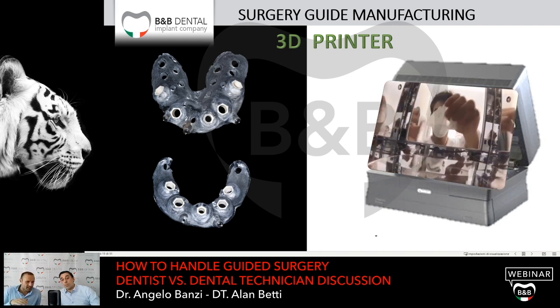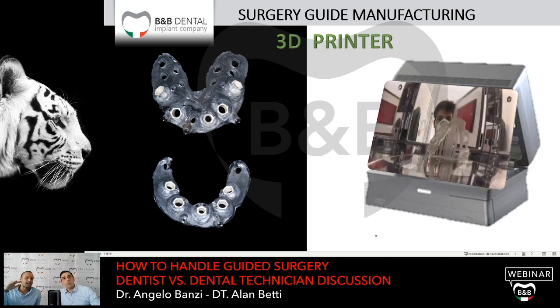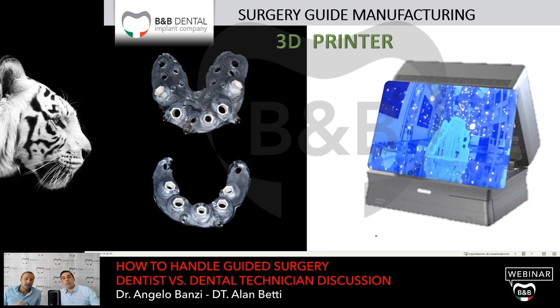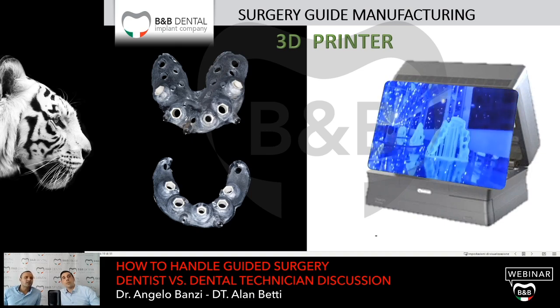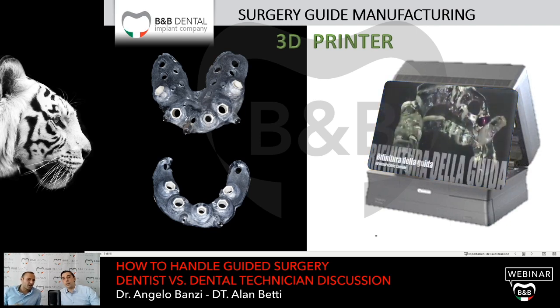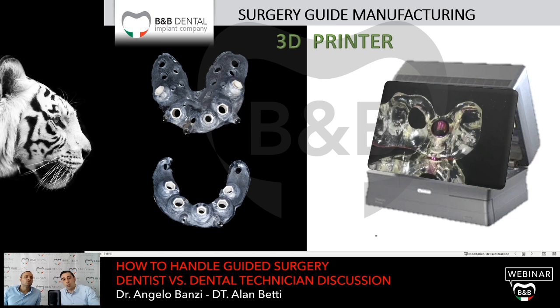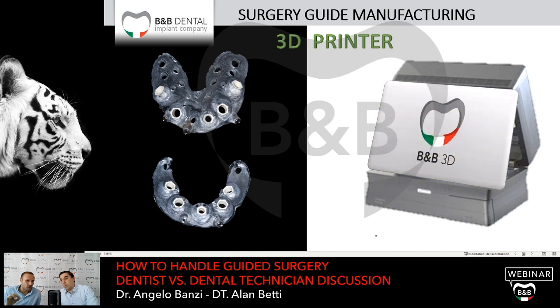3D printers work by creating the 3D object slice by slice, layer over layer. In this case, the surgical template. Which is the best thickness of layers, the minimum thickness that you can use to get a very precise surgical template? Which is the thickness of these layers?